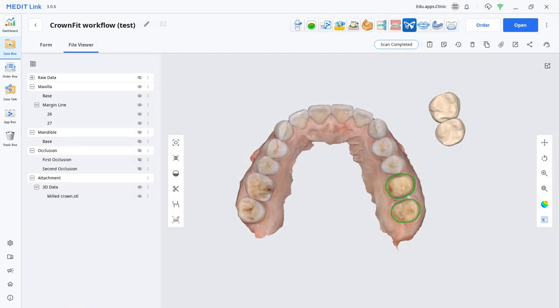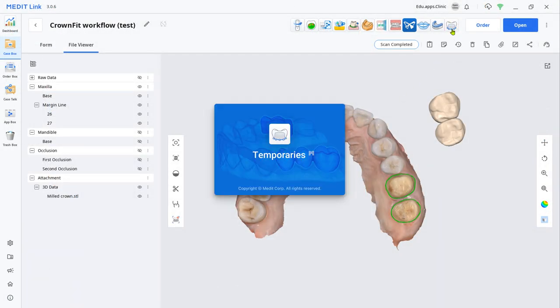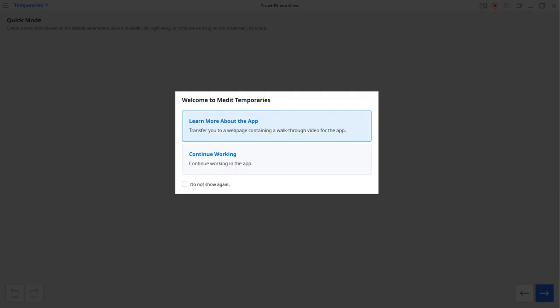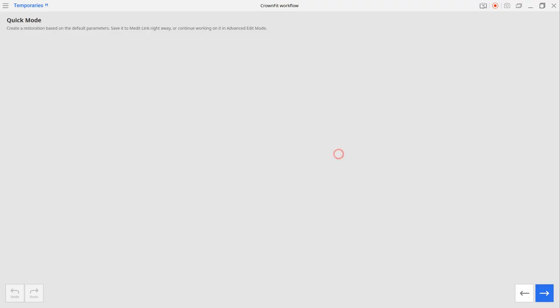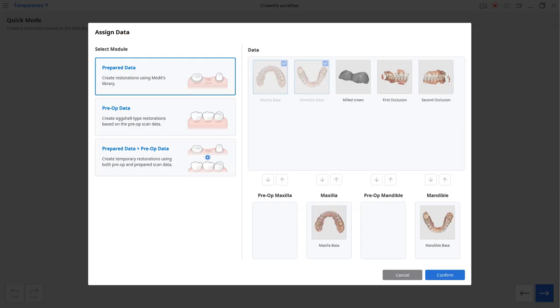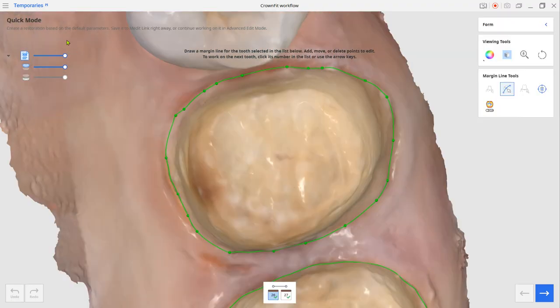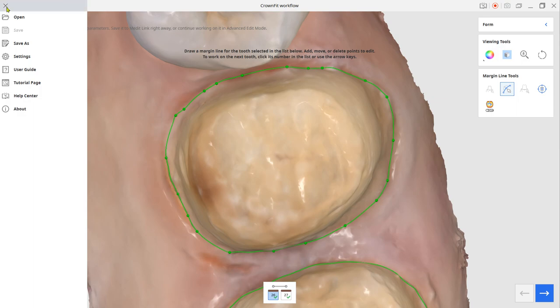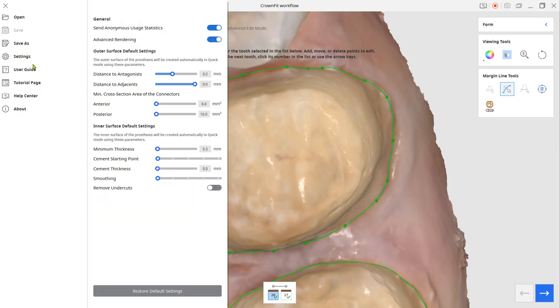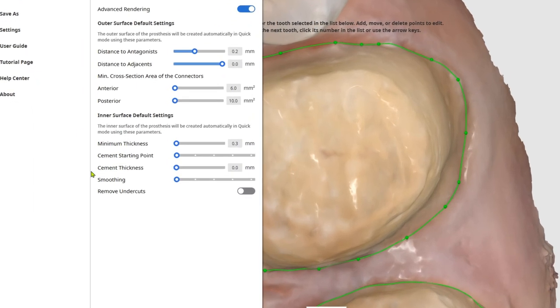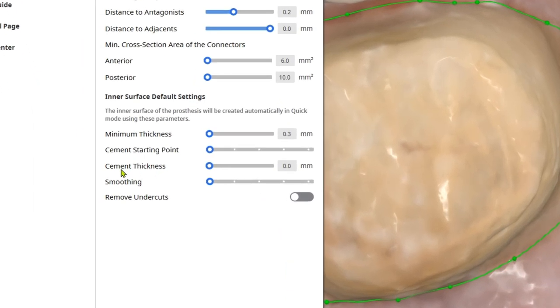After scanning, we are going to create a dummy CAD crown with the temporaries app. Load the scan file from the temporaries app and design with prepared data mode. Click the menu from the top left corner. Go to settings and make sure the cement thickness is zero for this crown.